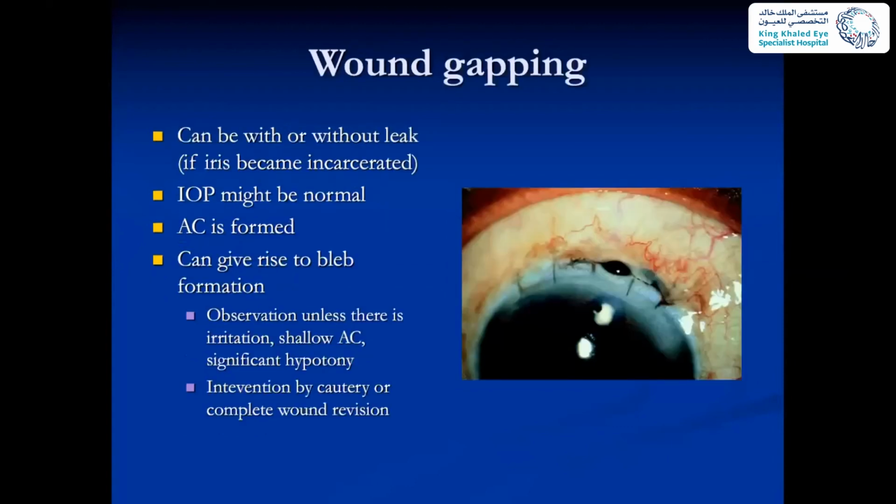Wound gaping. Wound gaping can have a leak or it can be without leak. The iris can come there and become incarcerated there, stopping the leak.